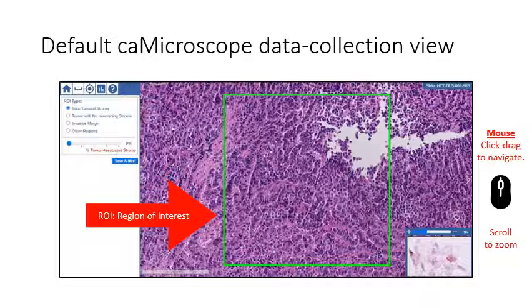Here is the default CA microscope data collection view. The main area contains a green box that is the region of interest for the current still evaluation. You can click and drag this image with your mouse to navigate around, and the mouse scroll wheel can be used to zoom in and out.